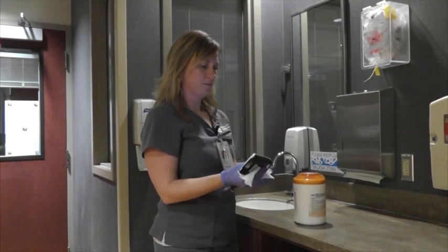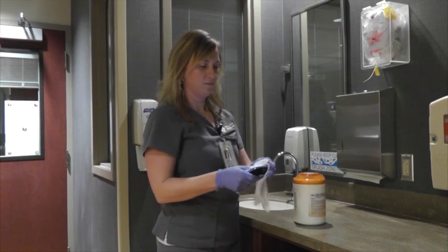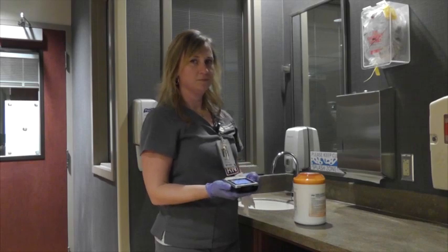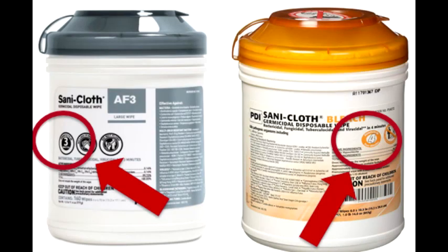This means the item must remain wet for the full wet time, but it does not have to be continuously wiped. It is appropriate to wipe the device and let it sit as long as the entire surface remains wet. Where do I find this information? Look on the product container's label.